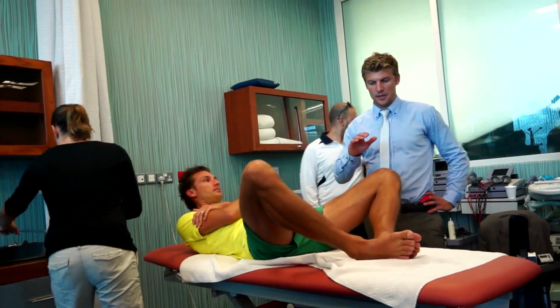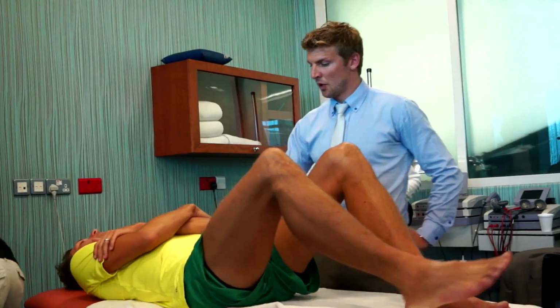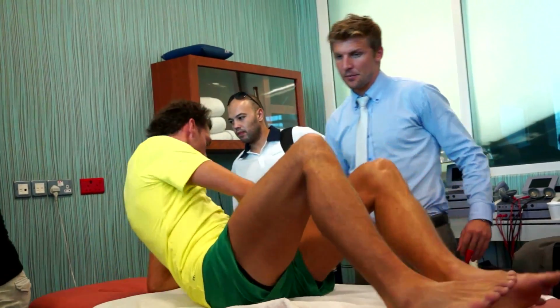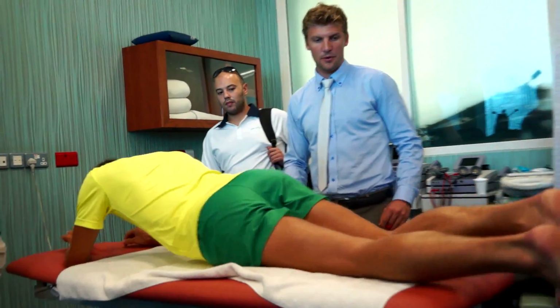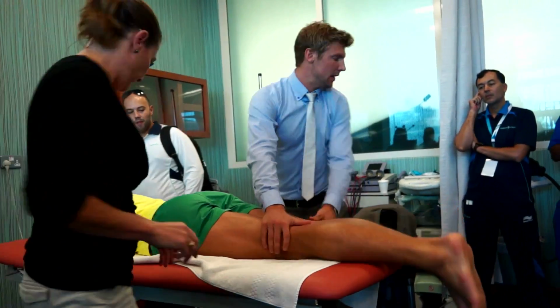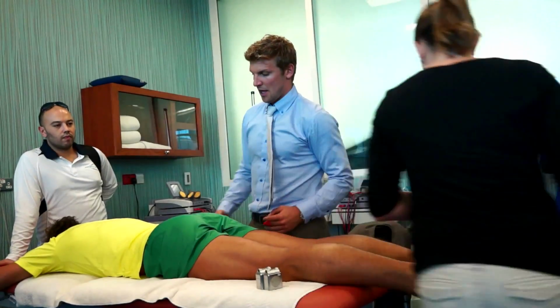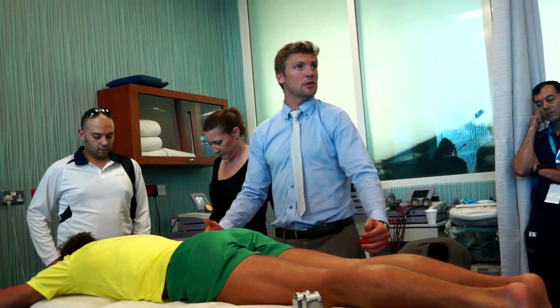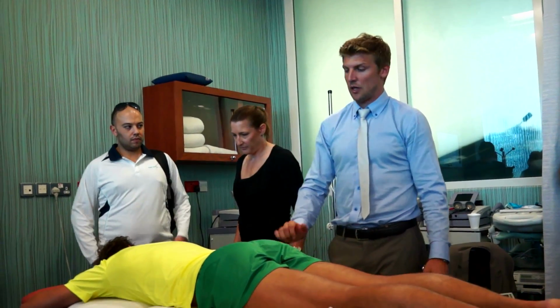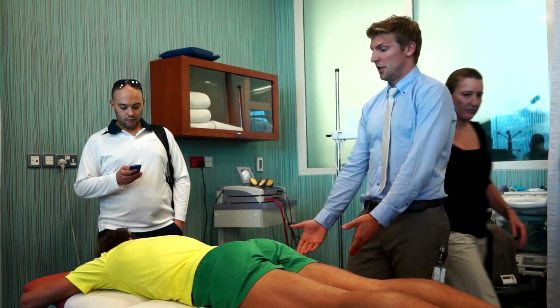Right, next measure is the internal rotation. As mentioned, this one we're going to do in prone. So if you get on your stomach and a little bit further down. Yep, perfect. And again, we're going to use the inclinometers here, digital ones. And here we wanted to test where we had the hip in 0 degrees, or as close to neutral as possible. So that's why we put them in prone, compared to the other measure where you put the hip in 90 degrees flexion.